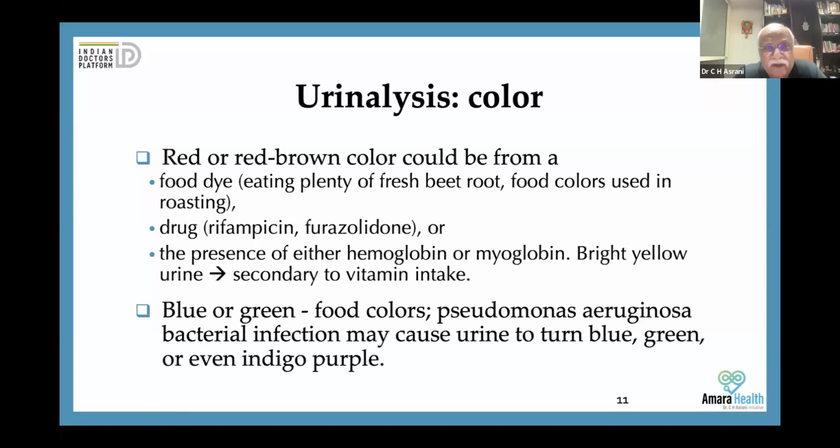Blue or green, either food colors, ask the patient, because a lot of tandoori items are made with green color. Nowadays, there are mocktails available with blue color. So ask the patient, have you consumed anything with blue and green color? Or it could be Pseudomonas aeruginosa bacterial infection that may cause urine to turn blue or green. So if the patient is symptomatic for urinary infection and has green or blue color urine, please get a culture and ABS done.